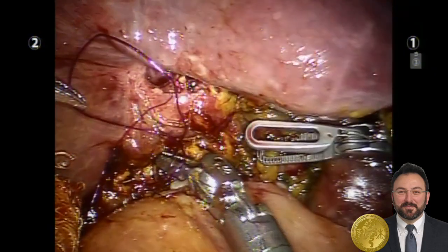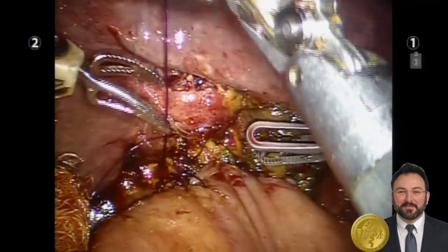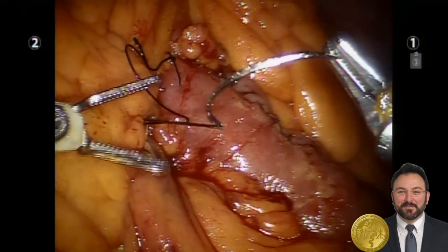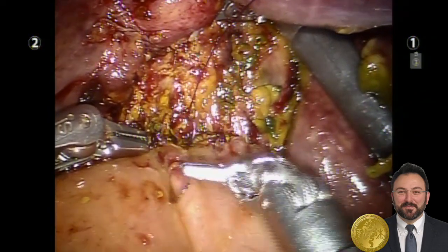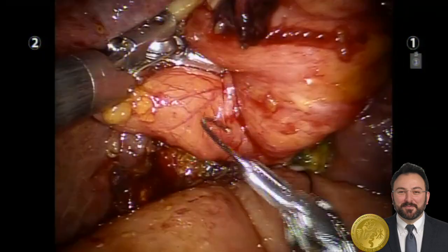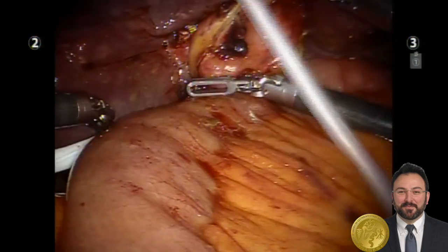Finally, using a running 3-0 spiraling knotless suture, the anterior layer for the entire hepaticojejunostomy was completed. All mesenteric defects were closed. The falciform ligament was divided and brought down to provide coverage over the new anastomoses, and a drain was placed.